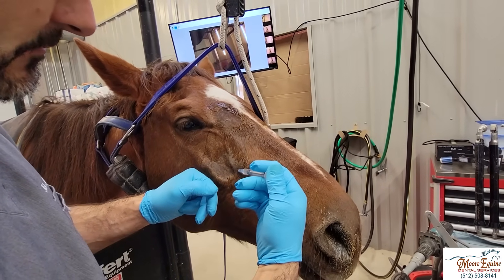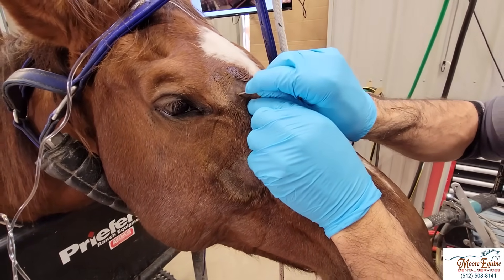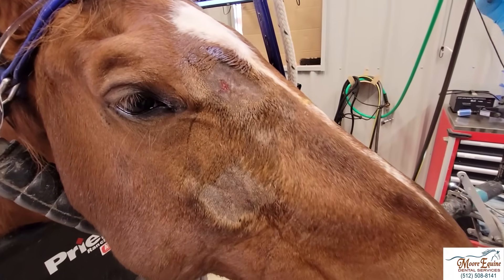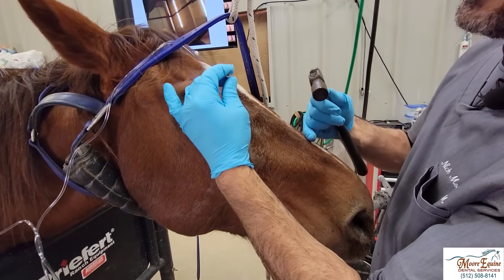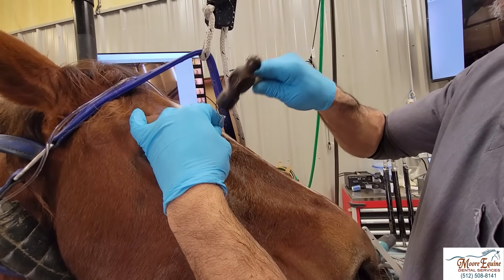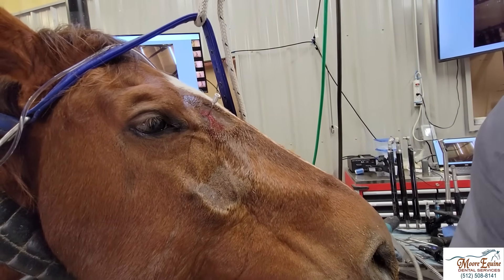I'm going to find the rostral aspect of the facial crest, go about an inch or inch and a quarter up from there dorsally, and come back just a couple centimeters with my block to numb this area. I use a 14-gauge needle and that's what I'm going to use to make my incision — a scalpel blade works too but the 14-gauge needle works well. Now I'm going to take the needle and put it right in here and start tapping. There we go — now we're inside the sinus.